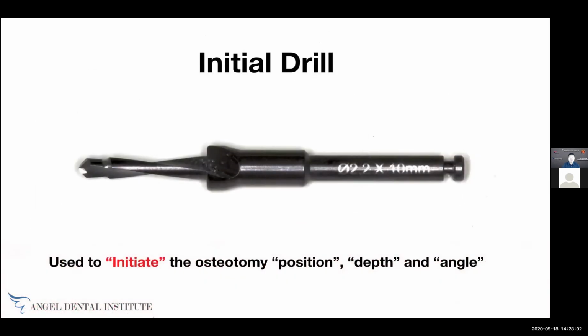I'm going to go through each one a little bit more in detail because we really need to understand these drills to be able to do your work properly. These are tools. So you just have to learn the tools and what they are and figure out what the engineers designed into them, okay? Here, the initial drill is used to initiate the osteotomy, position, depth, and angle, okay?